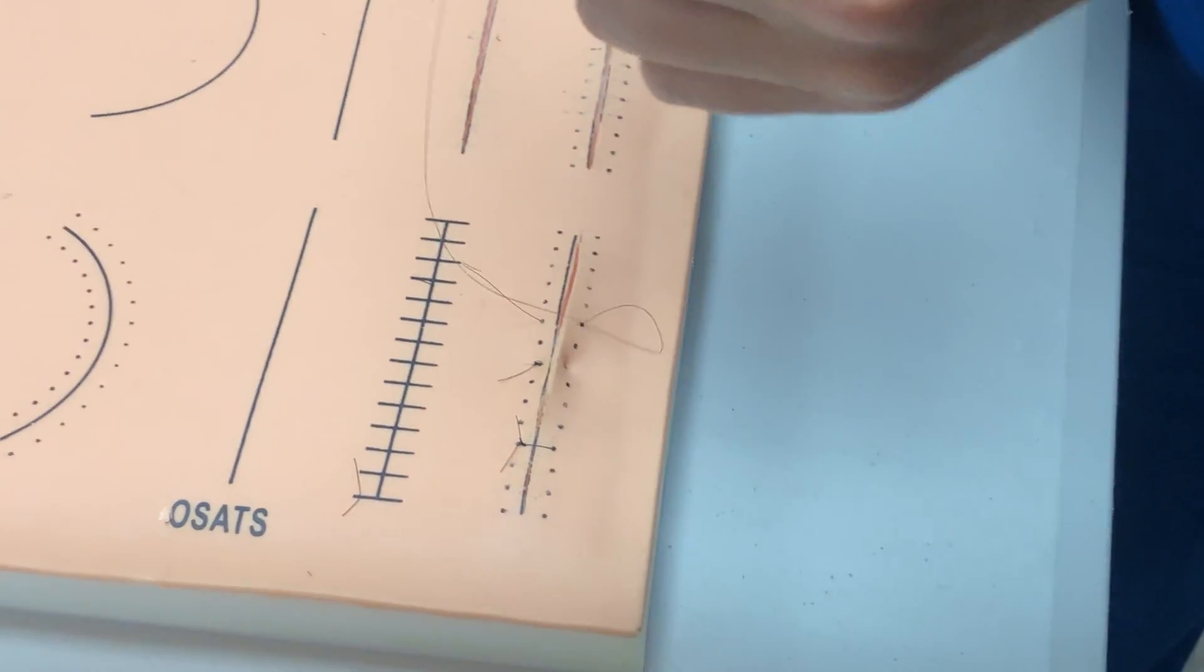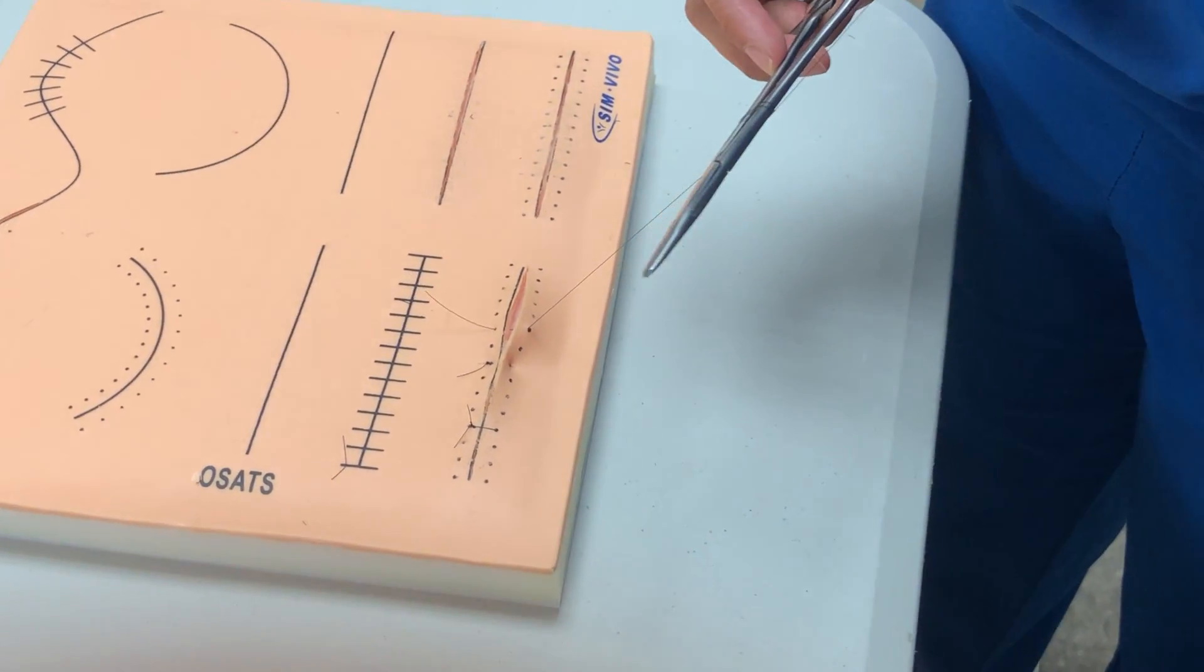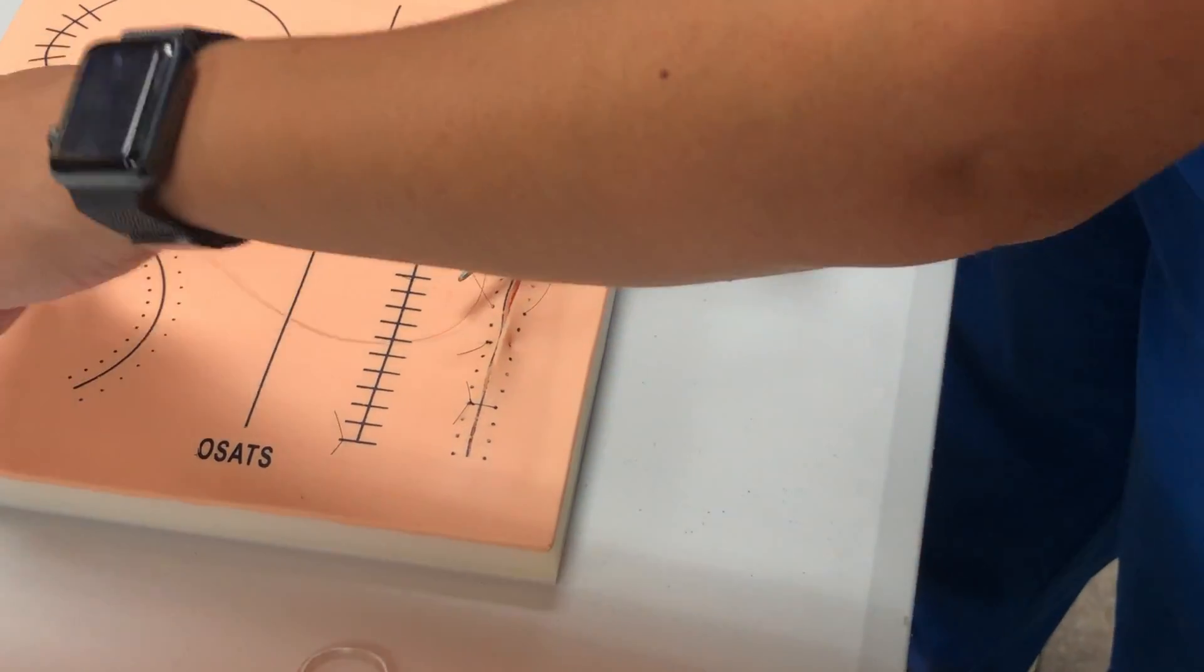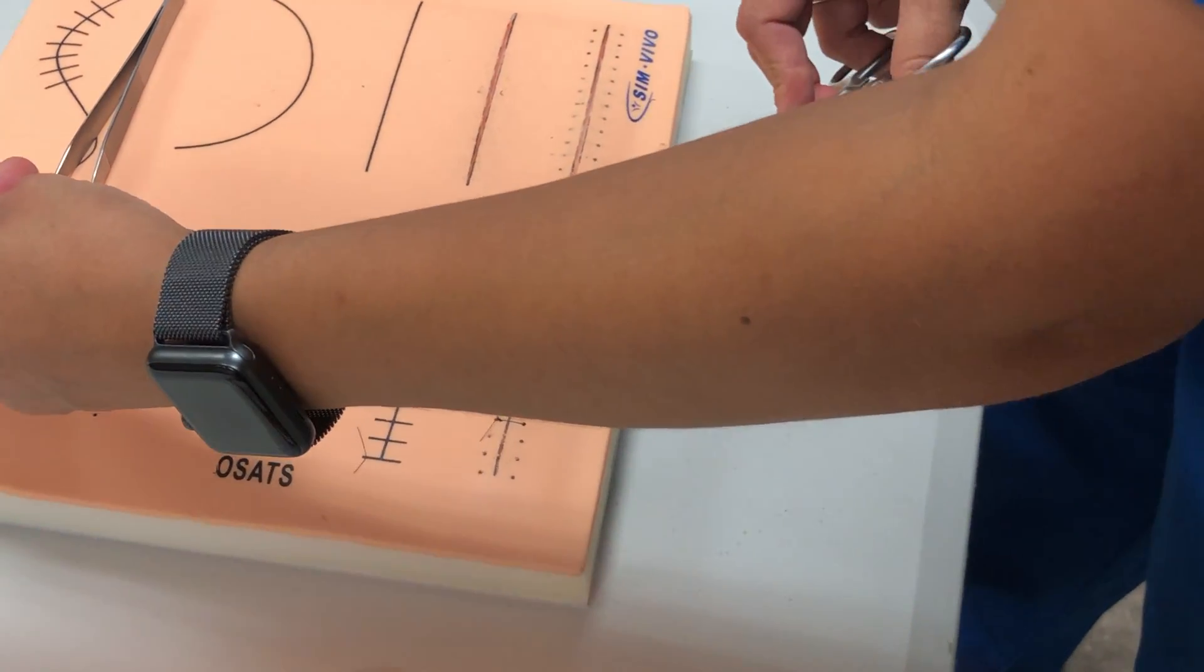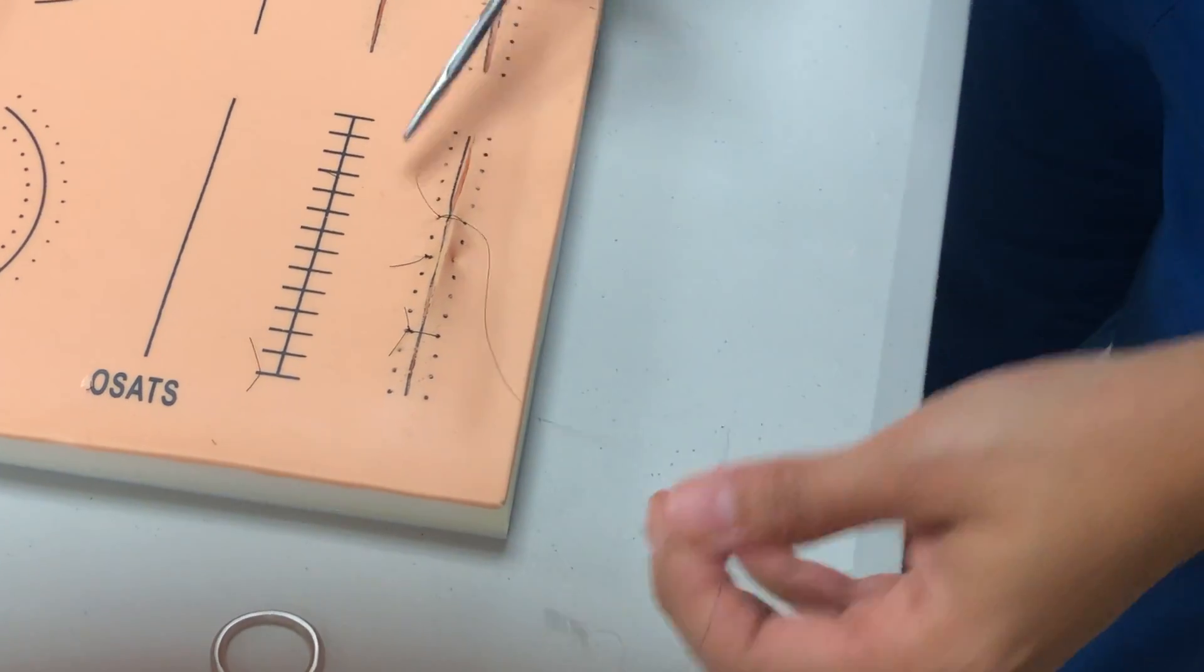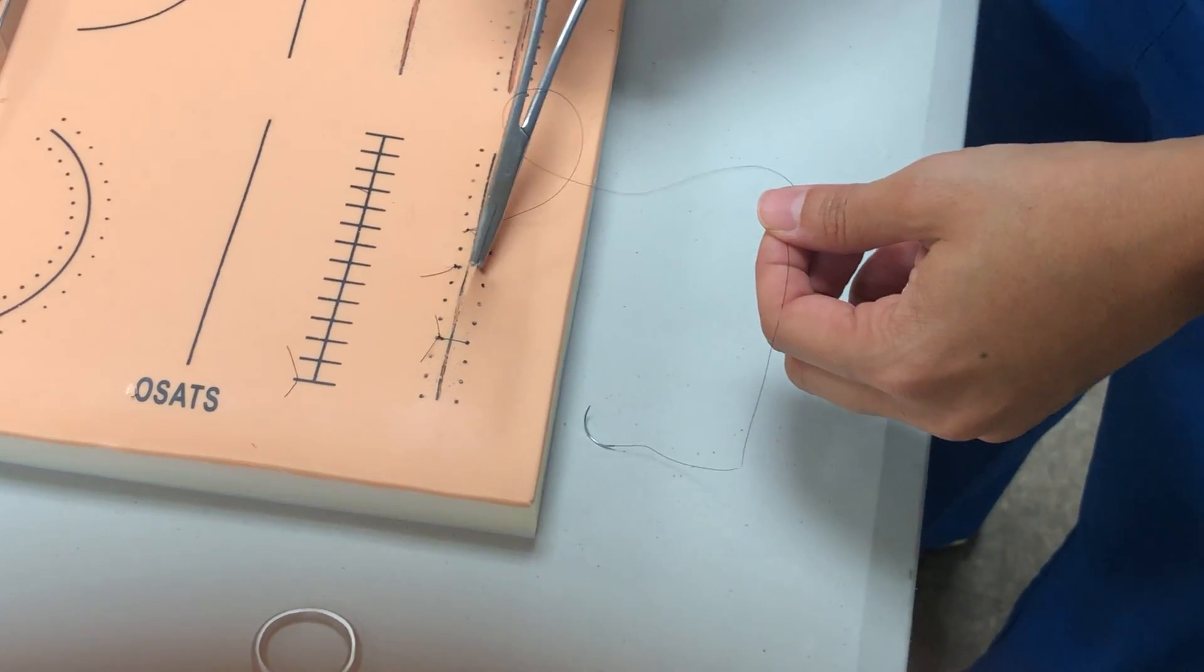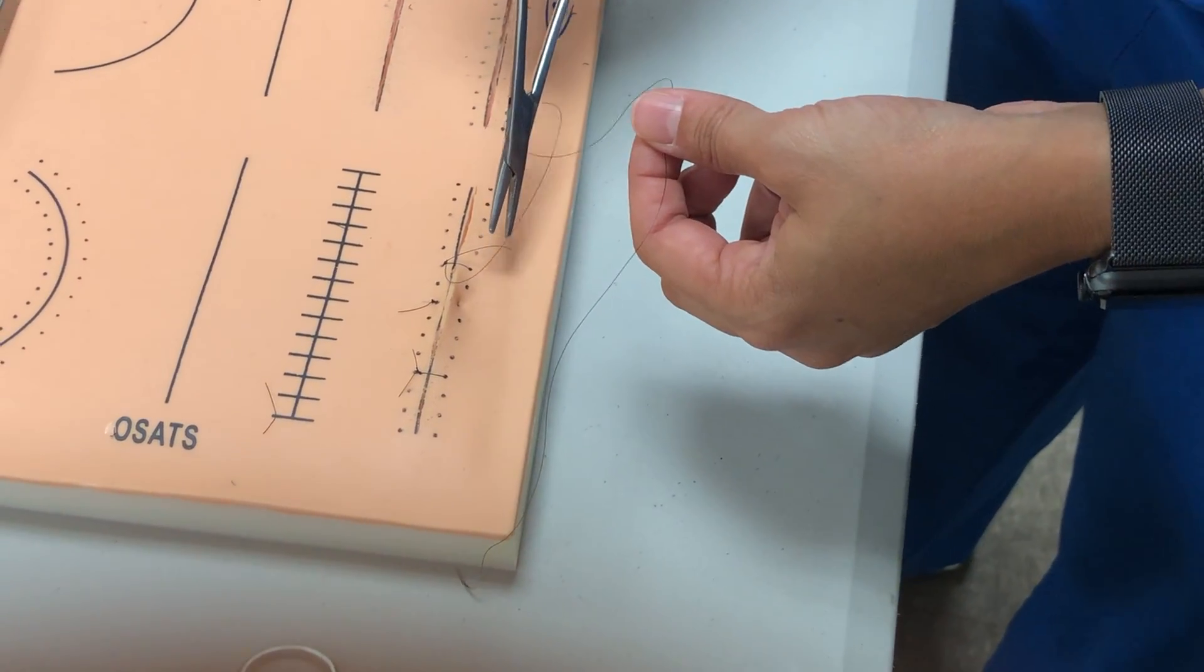Now I'm going to tie it off. I usually leave my forceps in my hand to just save time, but you can set them down while you're knot tying. Okay, I'll set our surgeon's knot and then laying it flat. So then we'll finish out our knot tying, but we're not going to cut it at the end because we want to keep it going.